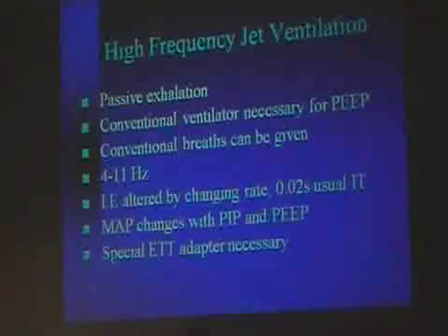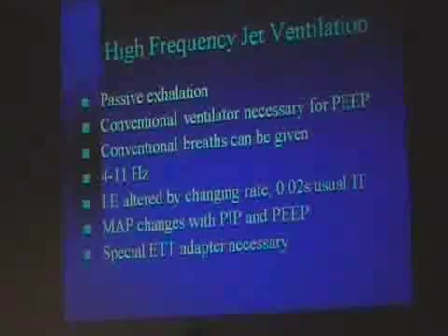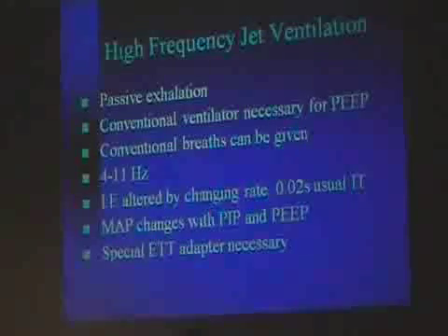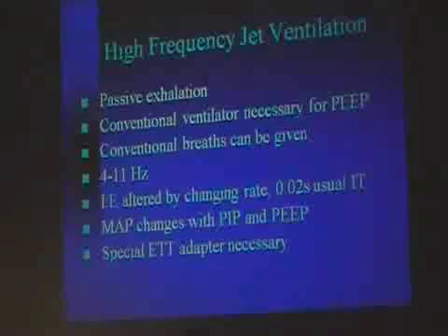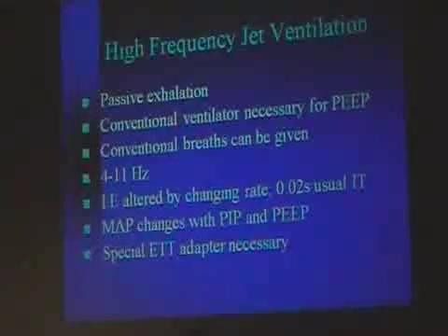Remembering that, as you change the rate on the jet, your IE ratio is going to change. So that's a critical part of the difference that I want everybody to understand. Are there any questions about that point?